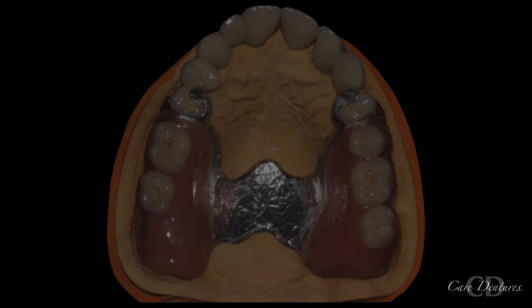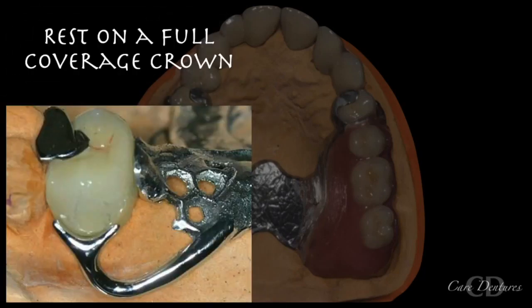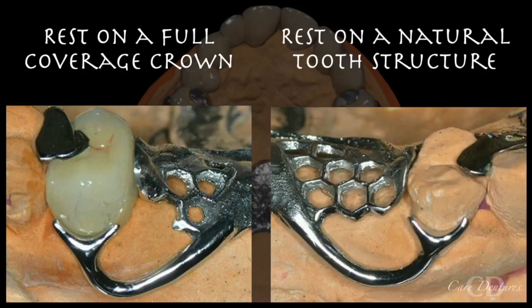In this video, I discuss a vital aspect in partial dentures. If you view a direct retainer of a cast partial denture, you can see a retentive, bracing, and a supporting component nicely placed together, no matter whether it is placed on a planned PFM crown or on a prepared natural tooth. Let's focus on the supporting component of a partial denture today. I'm talking about a rest approximating a prepared rest seat on the abutment tooth.